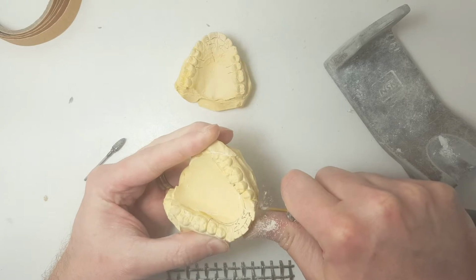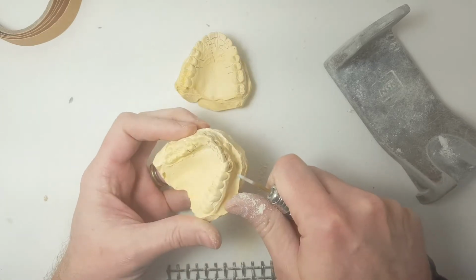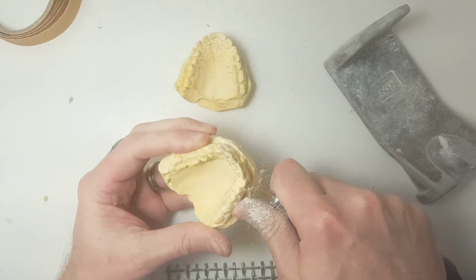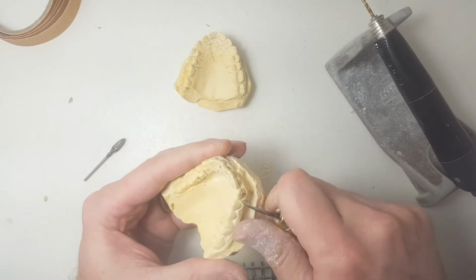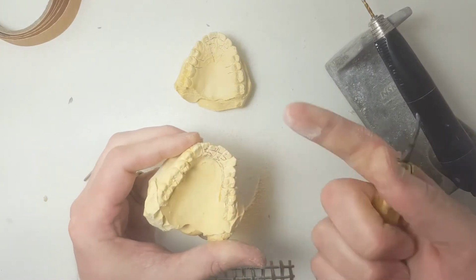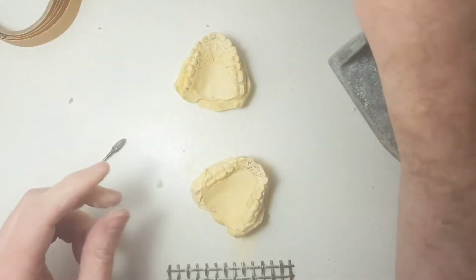So I'm going to drill here, usually between the 2 and the 3, and then I'm actually going to go between the 3 and the 4 here. I just realized, out of habit, I didn't score between those teeth, and I didn't mark it, but I can kind of tell what it is.